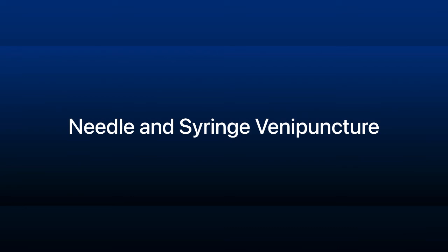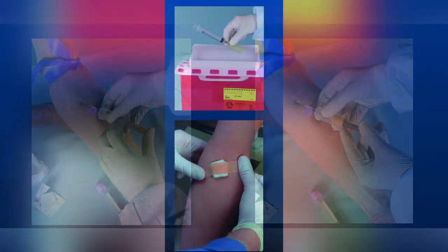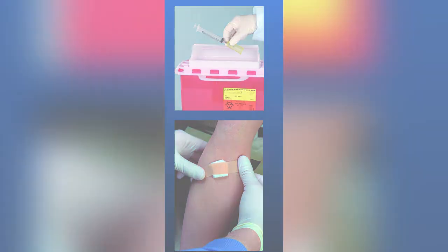Prepare equipment and put on gloves. Reapply tourniquet, uncap and inspect needles. Ask patient to make a fist, anchor vein, and insert needle. Establish blood flow, release tourniquet, ask patient to open fist. Fill syringe. Place gauze, withdraw needle, activate safety device, apply pressure. Discard needle, fill tube, discard syringe, and transfer device.